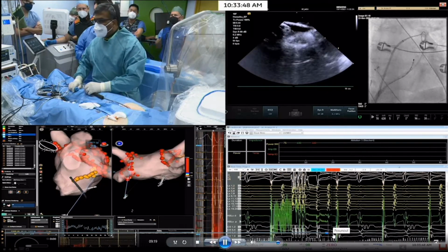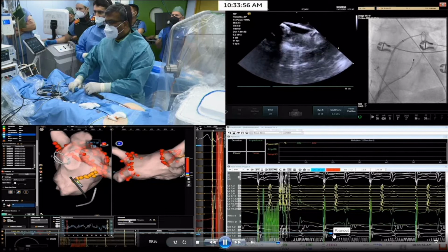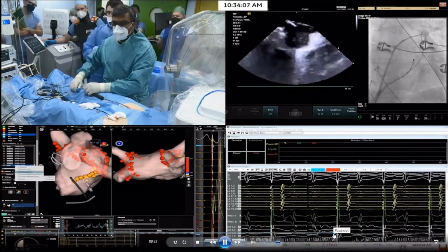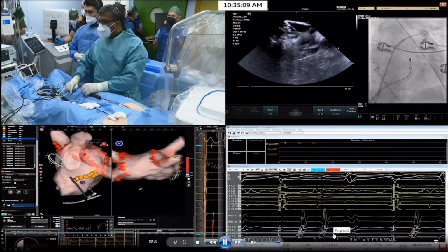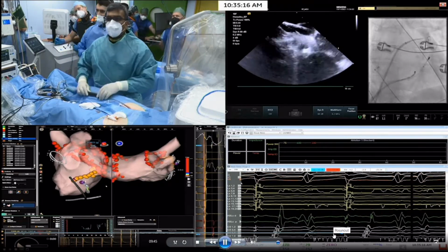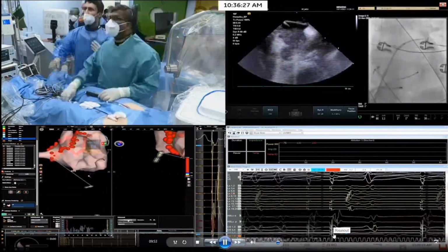So after this CS application, look, it's one single pulse. He decided, since he is really close to the ventricle or in the coronary sinus, to switch from 3 pulses to 1 pulse only. And he marked it on the mapping screen. You can see this CS application or single, and then for sure we continue with the lesion on the right side.